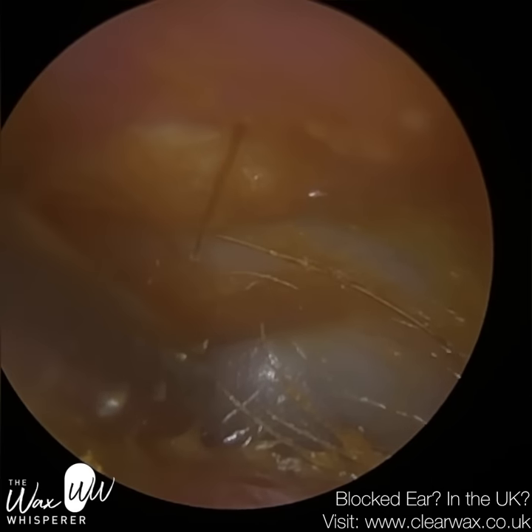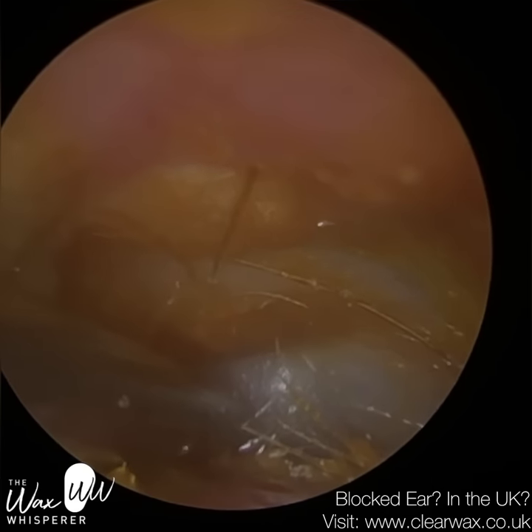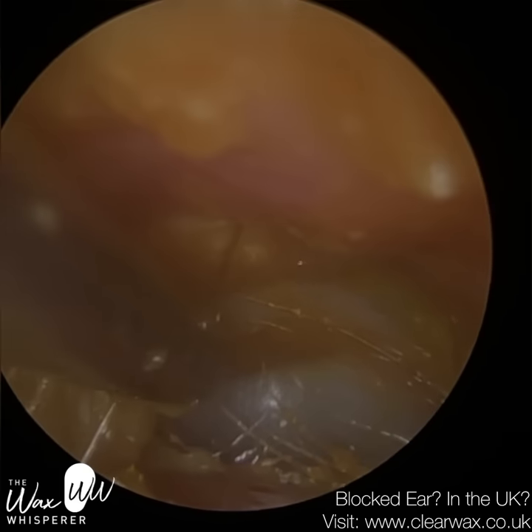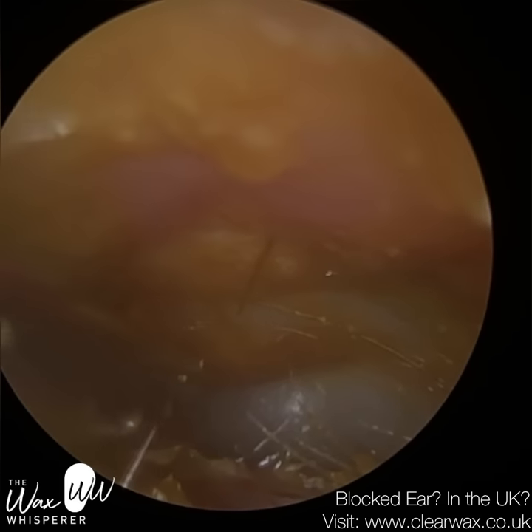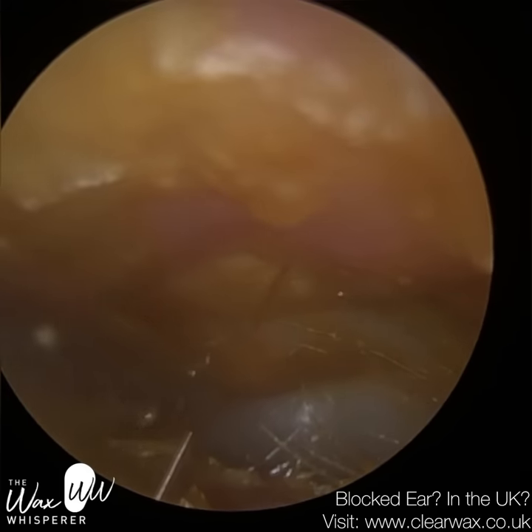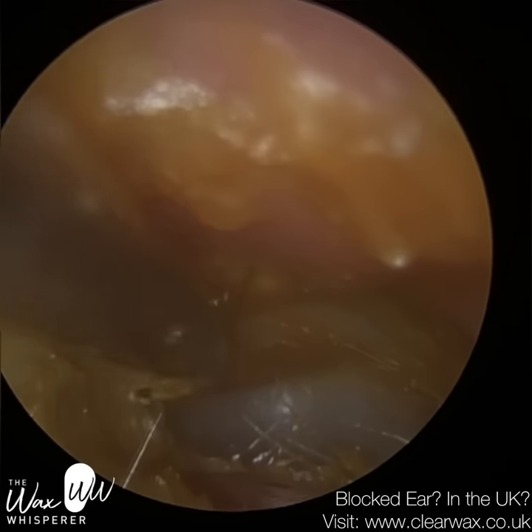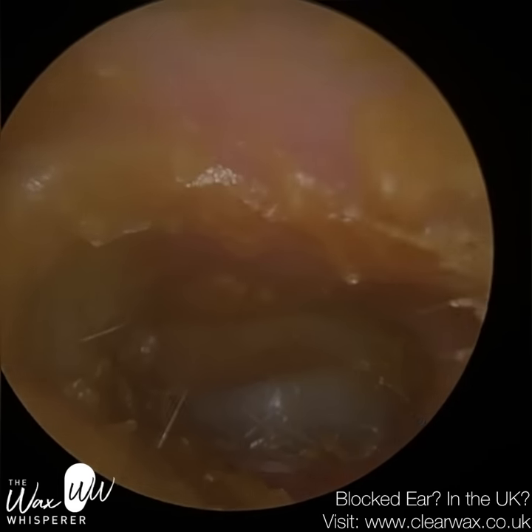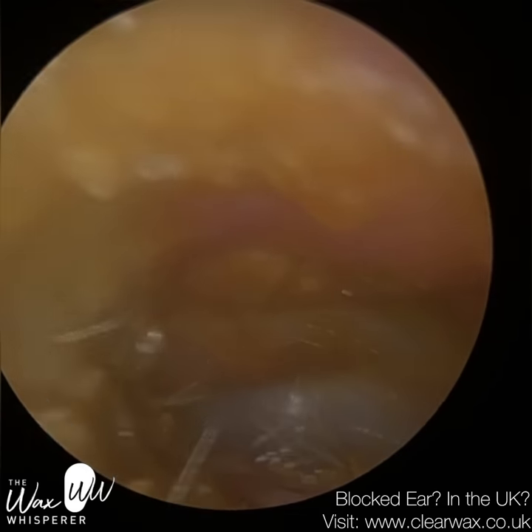It's almost like your shin region or your elbow — they are very sensitive because the bone is really exposed. And so this patient's ear canal diameter is approximately 0.5 to 0.6 in terms of width, and the height is probably 0.7. So it's a really small cavity, and there are bends and twists in there.